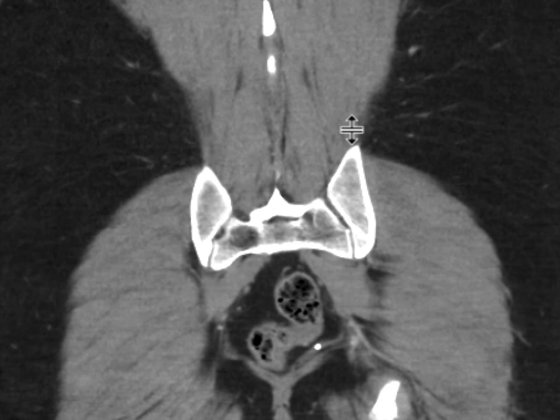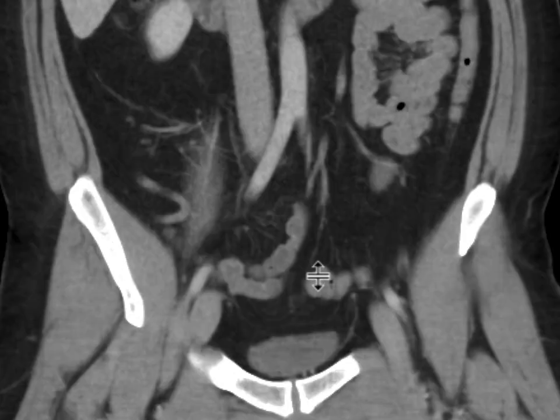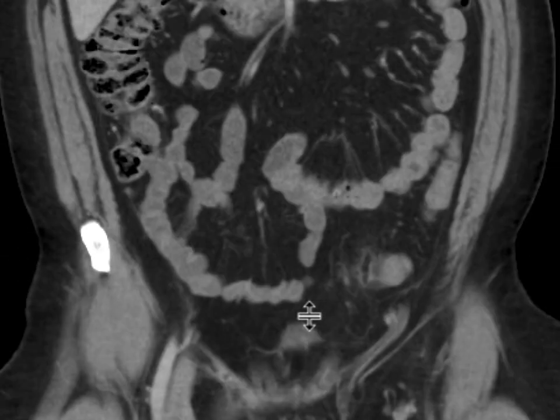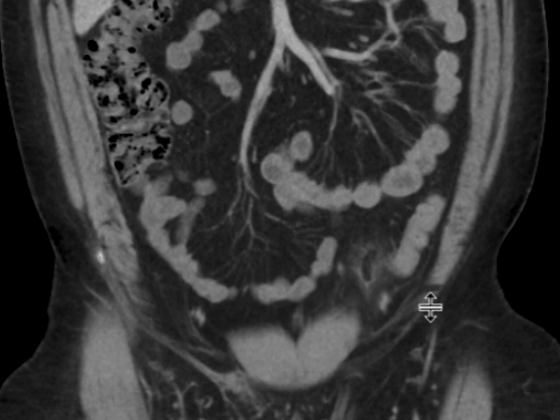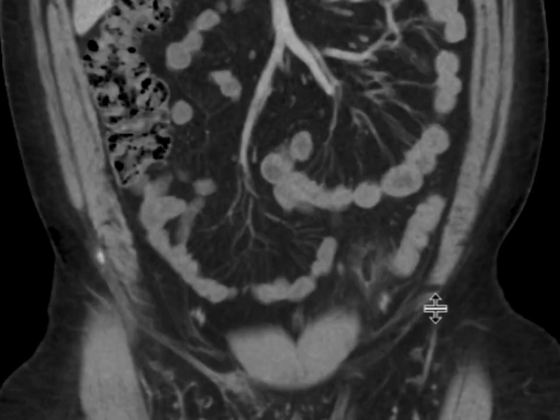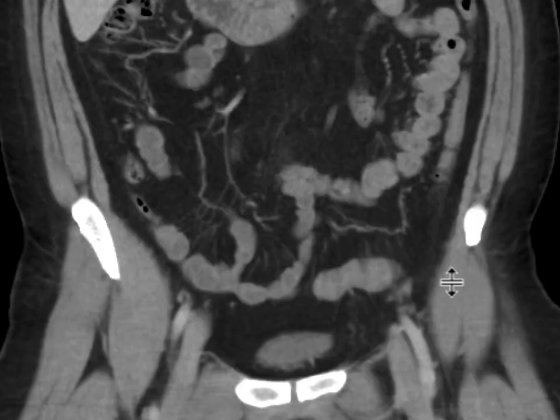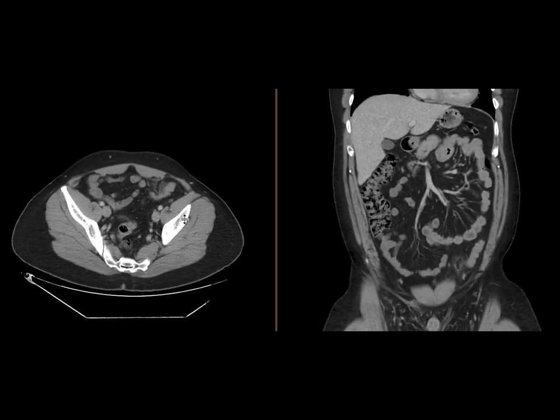We can see similar findings on the coronal CT image of this patient, where we see a somewhat oval-shaped, fat-containing mass with a hyper-attenuating rim and a little bit of inflammatory change adjacent to the sigmoid colon.